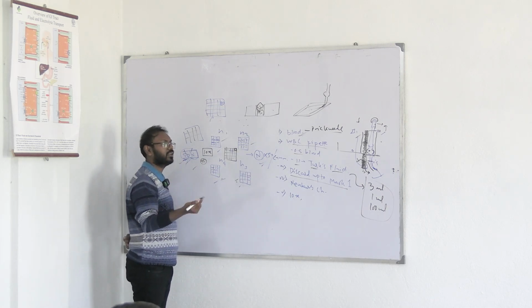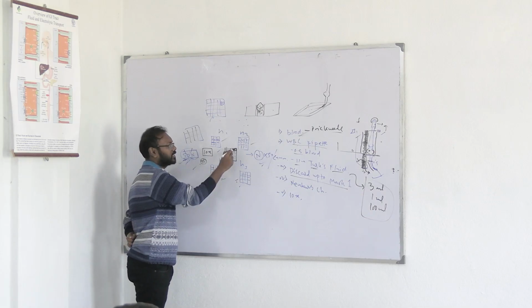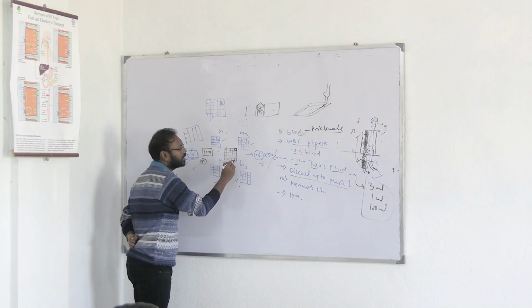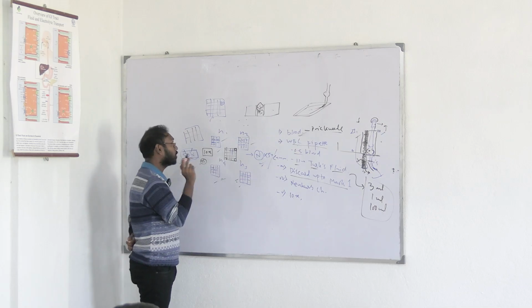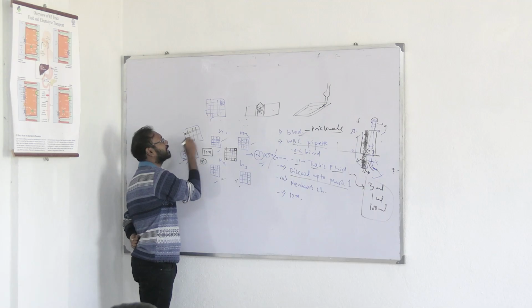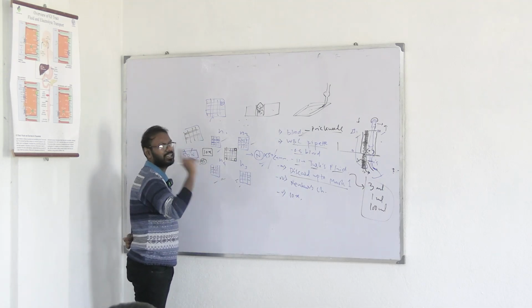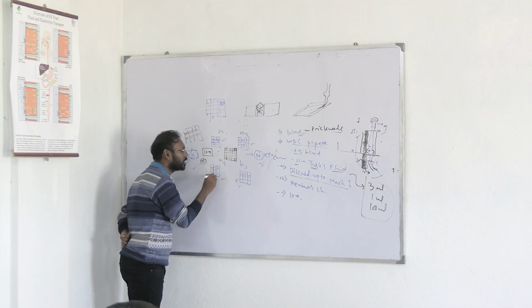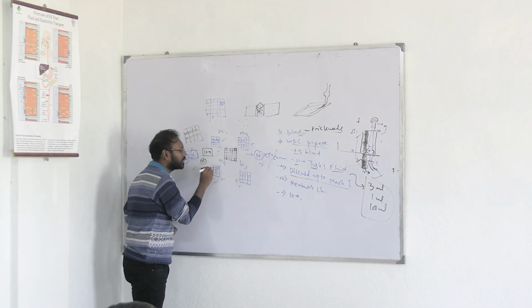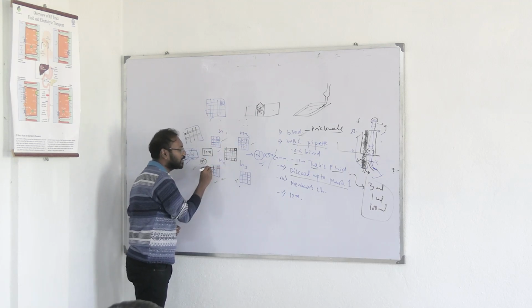And again, if anyone has mistakenly put it in 45x and considers it a WBC chamber because they are also present on the sides, it can happen. Always remember these 4 into 4 are multi layered. Here you will see three lines each. There are 3 lines, but in WBC clearly only one line will be present. So if you think there are multiple lines here, in those RBC chambers, small chambers, there will be multi lines.